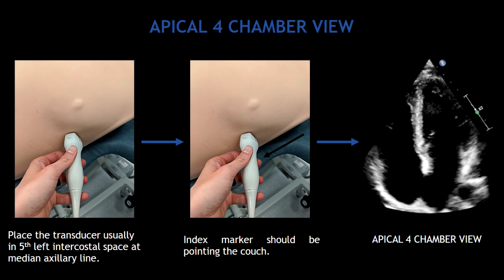The first view I'm going to show you is the apical four-chamber view. To obtain this view, first you have to place the transducer in the fifth left intercostal space at the median axillary line. The index marker should be pointing to the couch, and just by doing this you should be able to obtain the apical four-chamber view.